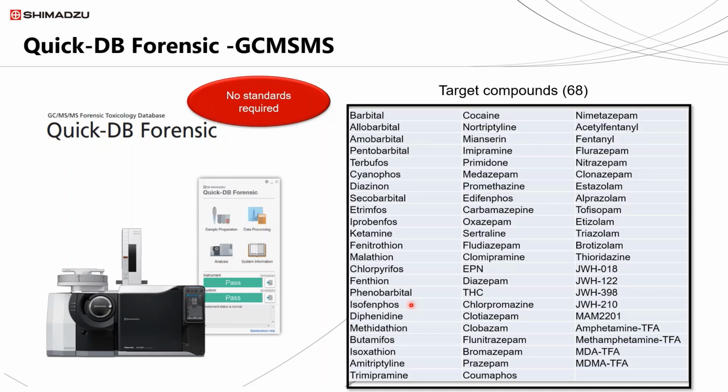This is a semi-quantitative method, which does not require any standards for analysis. It uses only 6 deuterium-labeled internal standards, which behave almost similar to the registered compounds. So the quantification is possible only by comparing the internal standard response. It does not require any other standard for analysis. So it is a quick, fast, and semi-quantitative analysis for toxicological samples.